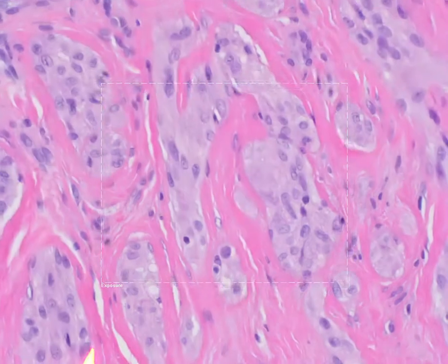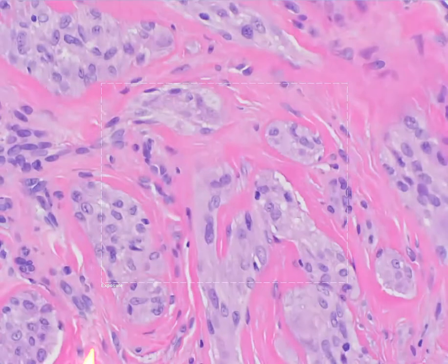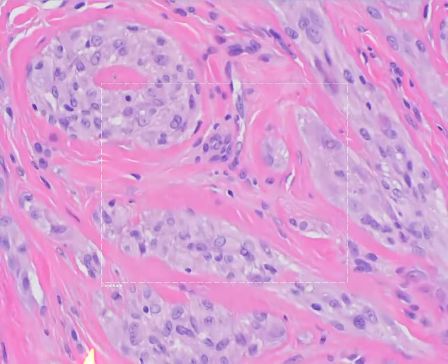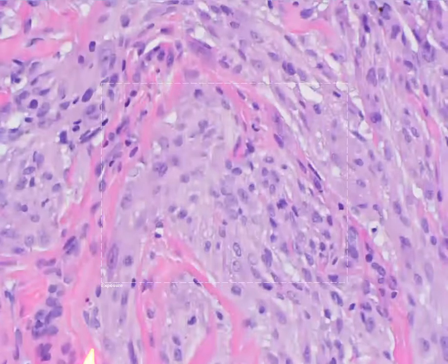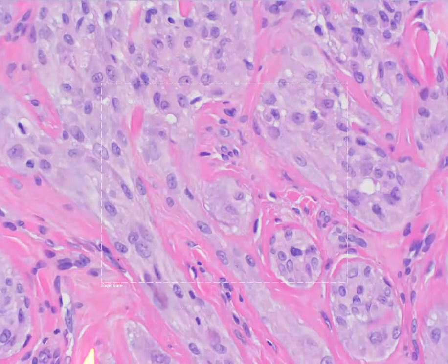We've seen a few mitoses already. So you can see these large ovoid nuclei, ample eosinophilic cytoplasm, very epithelioid appearing, not the wavy nuclei we're used to seeing in some of the other neural proliferations that we've been chatting about.